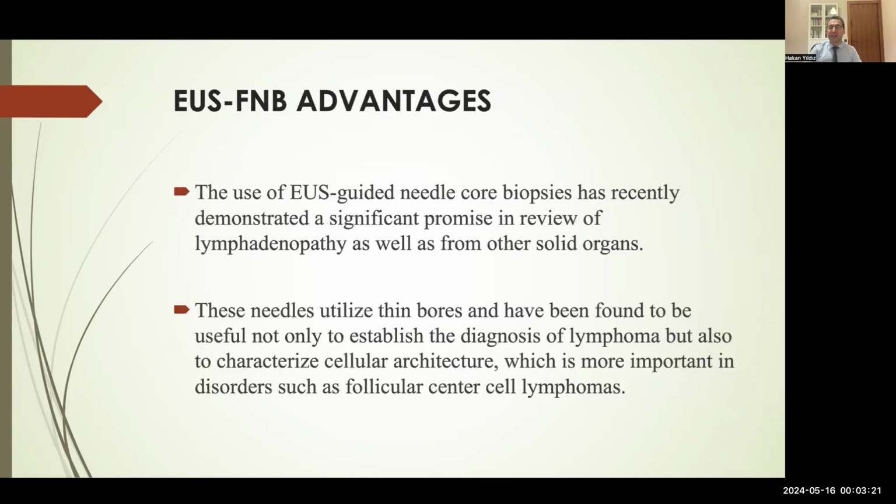Use of fine needle biopsy, advantages. The use of EUS-guided needle core biopsy has recently demonstrated significant promise in the review of lymphadenopathy as well as other solid organs. These needles utilize thin bores and have been found to be useful not only to establish the diagnosis of lymphoma, but also to characterize cellular architecture, which is more important in disorders such as follicular center cell lymphomas.